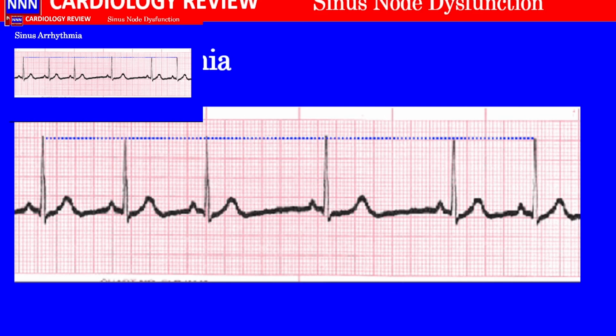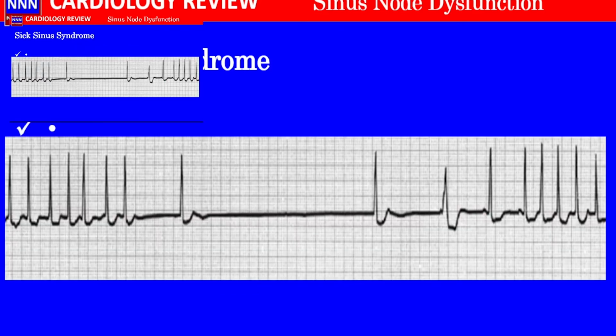Sinus arrhythmia is supposed to be an increased vagal tone, but clinically it should not make much difference unless you are seeing ectopic atrial beats along with that, which may suggest the development of atrial fibrillation in an unstable cardiac patient, which I have seen.